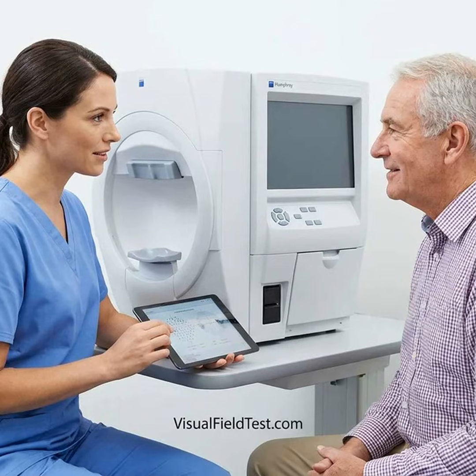Blinking is allowed. A short pause can usually be requested if the patient becomes tired or uncomfortable. The test is not an examination that can be failed through one or two missed responses. A learning curve is common. Repeated testing can improve attention, response timing, and understanding of the procedure, although a better result after practice does not necessarily mean that the eye itself has improved.